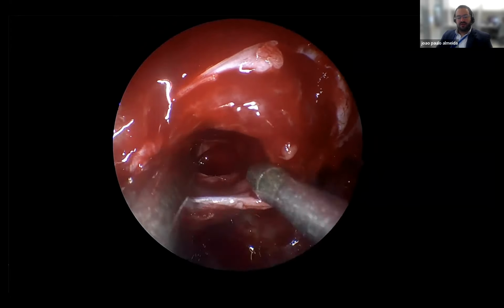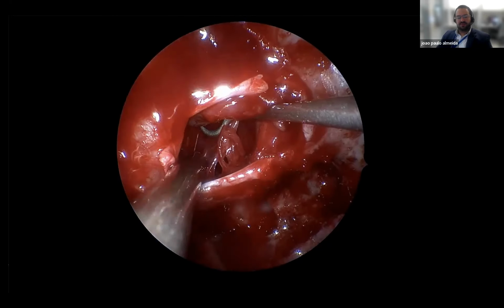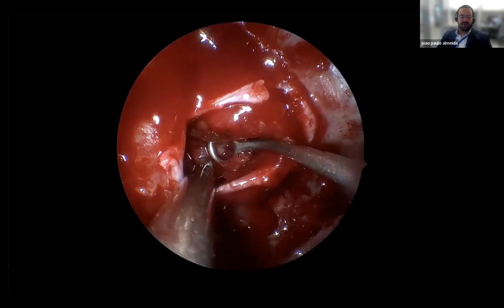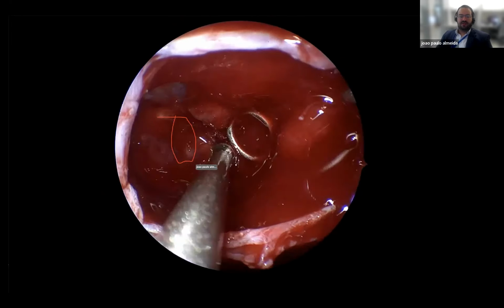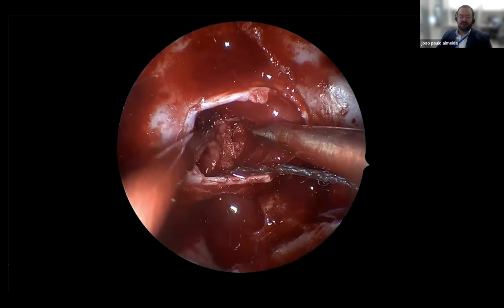Then in this area here, we start going towards the cavernous sinus, and we need to mobilize all that tumor. So you see with an angle curette, you can dissect and use it as a dissector and clean it away from the medial wall of the cavernous sinus. And you can see that wall is clean here. And with that dissection, we can continue working. You gotta inspect, you gotta make sure everything is clean.